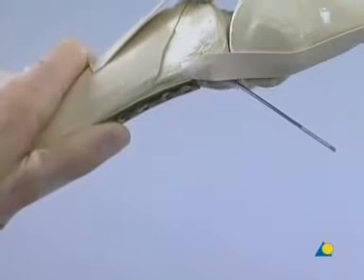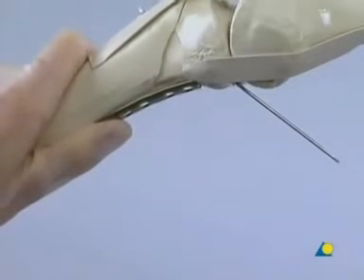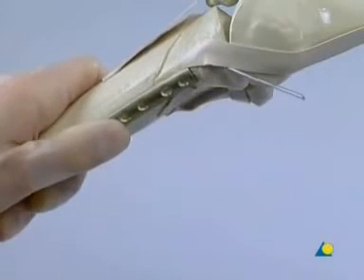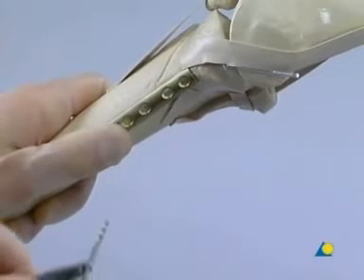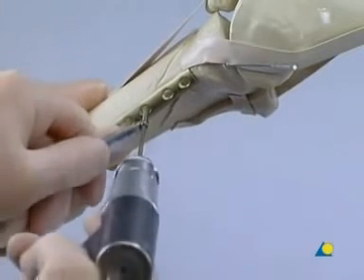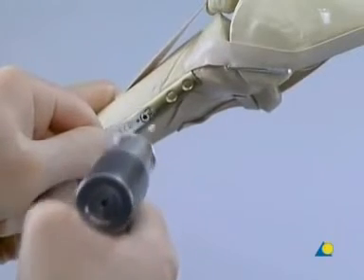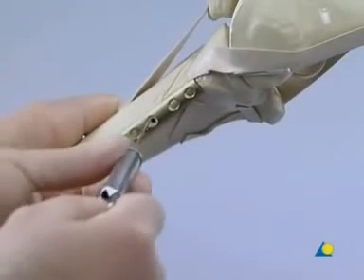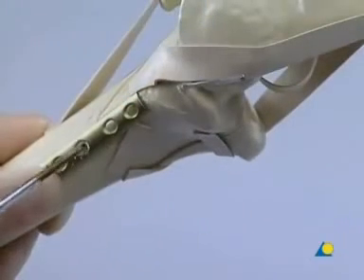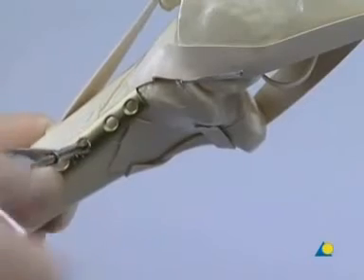A 5-hole 1/3 tubular plate is positioned on the posteromedial crest of the tibia. Only minimal plate contouring is required, if at all. Next, a 2.5 millimeter hole is drilled, just distal to the apex of the fracture, using the appropriate drill guide. A depth gauge is used to measure. A 3.5 millimeter tap and corresponding sleeve are used to cut the threads.